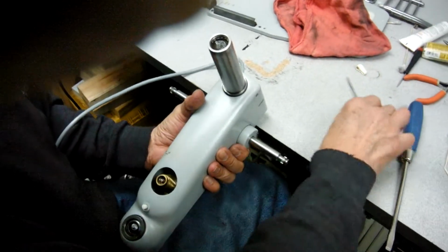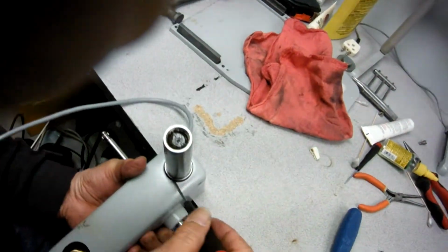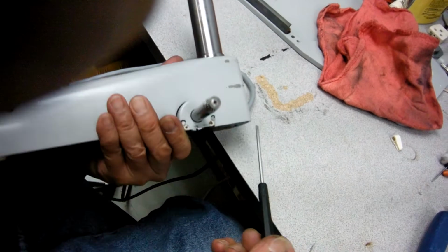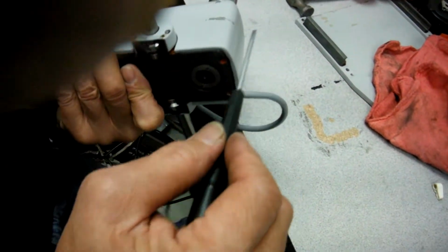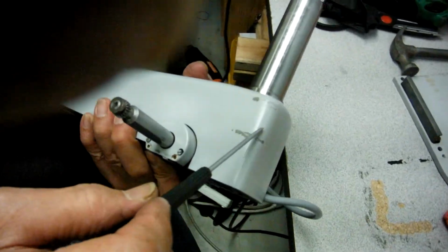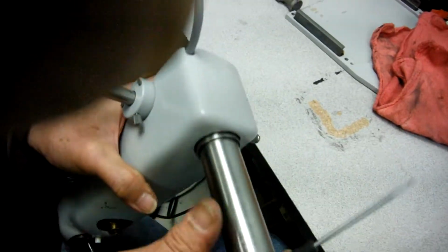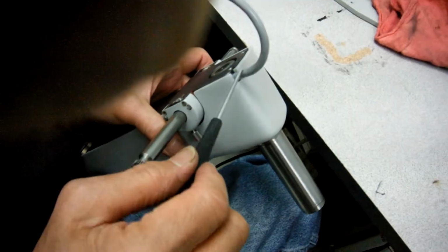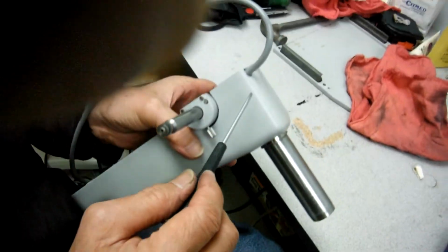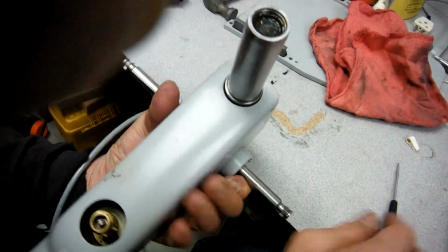And again, make sure when you do that, this has to be as even around as it can be. If one side sits too close in there, that means you need to shim inside there, inside the part right here. Sometimes they have a little washer inside there. So when you take your cover apart, make sure which side they have a washer, because some of the bases that come from manufacturing, they already shim some washers inside there to make this even around.